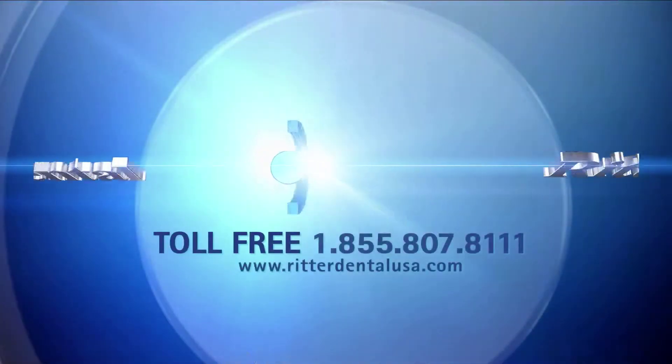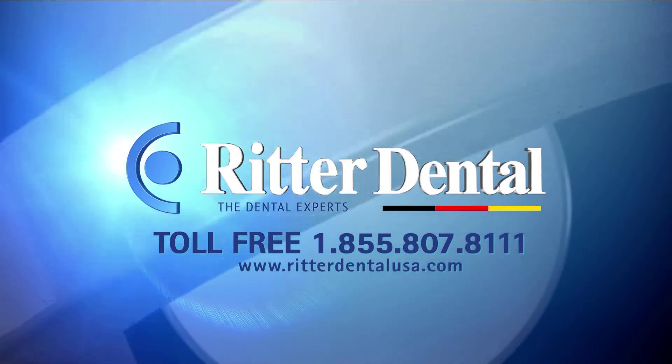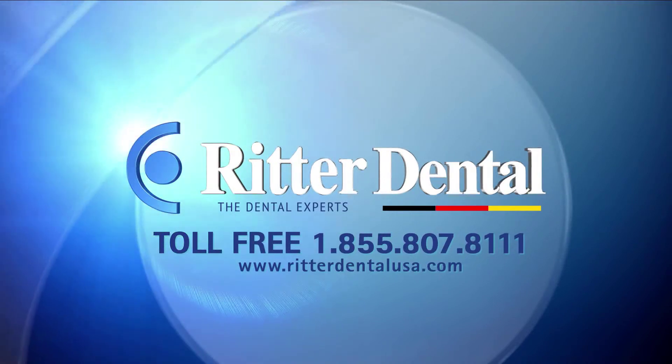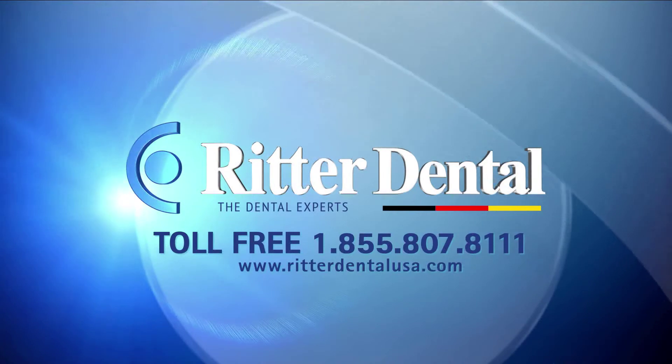For more information on any of Ritter Dental's products, please visit us at www.ritterdentalusa.com or call us toll-free at 855-807-8111.